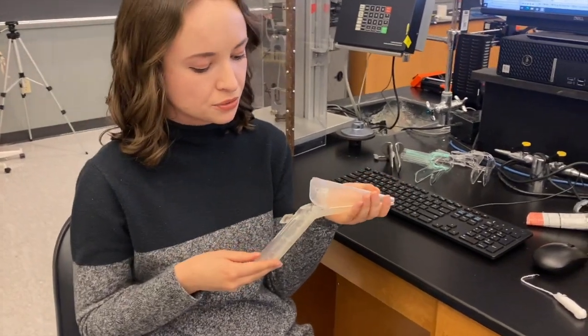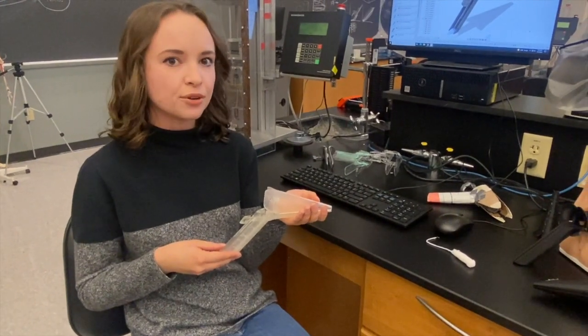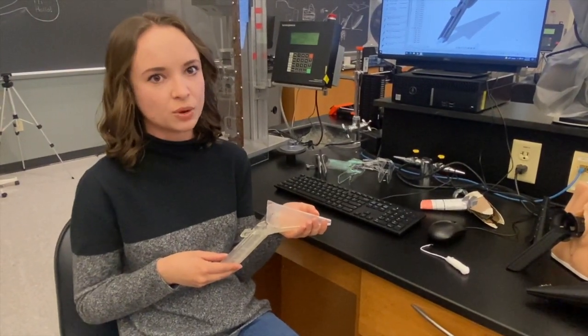The speculum also features an angled handle of approximately 130 degrees. This allows for provider comfort during use and prevents any unwanted contact between the provider and the patient.